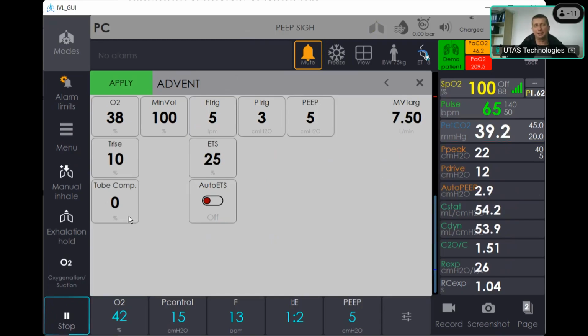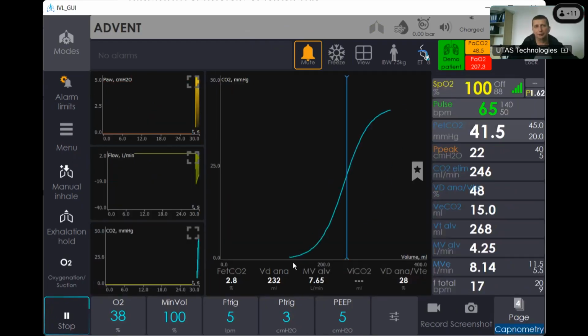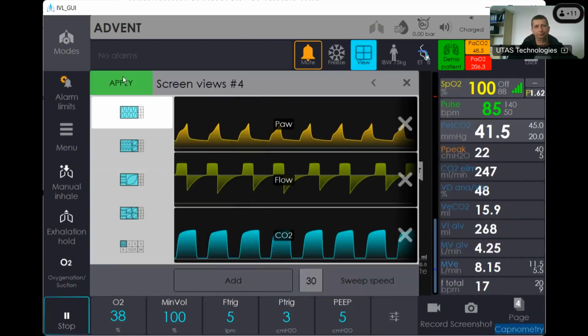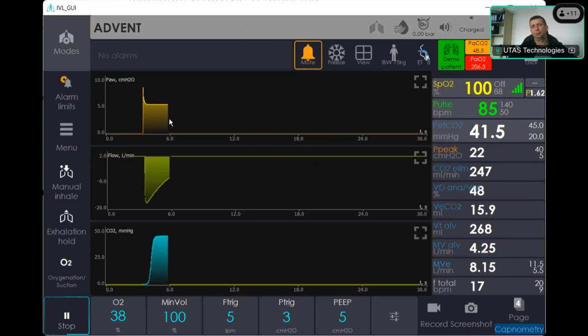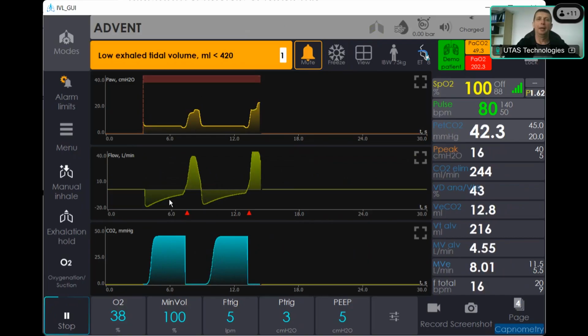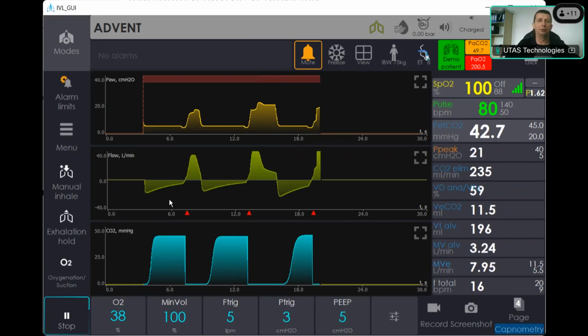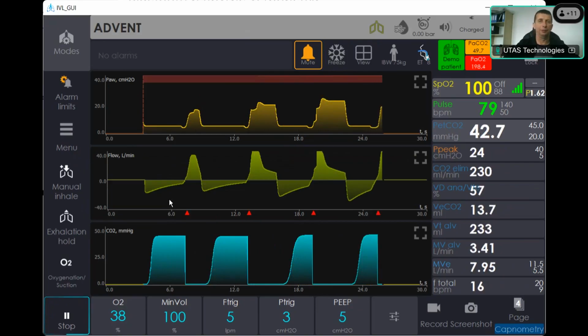As soon as we select this mode, we're selecting just a strategy of ventilation, sensitivity of triggers and PEEP level, and then ventilator will perform test breaths. Let me switch to classic ventilation. The ventilator applies test breath, receiving first parameters related to breathing mechanics and compliance resistance, and after that, adjusting the ventilation settings according to received data from the closed loop ventilation channel.